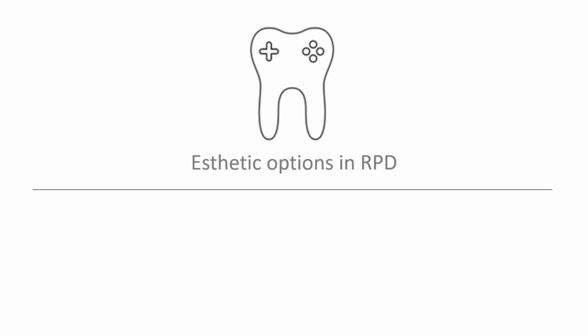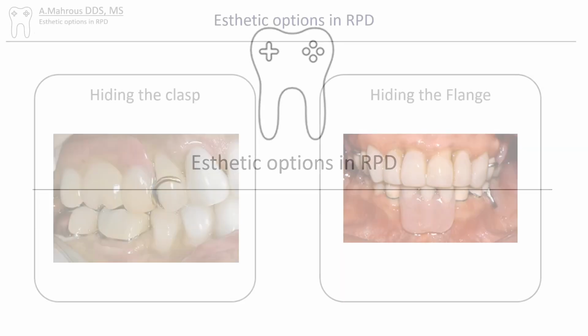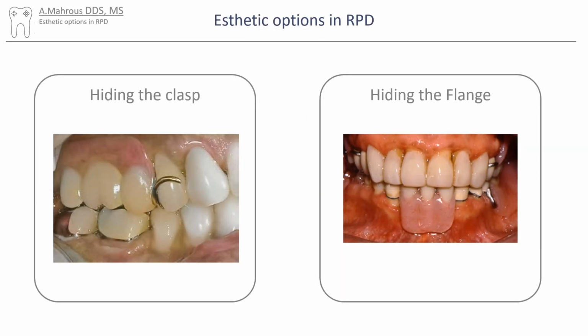In this video, we'll go over aesthetic options for RPD. There are two main goals in making an RPD aesthetic: hiding the clasp and hiding the flange. We'll go over the various techniques that we can use to achieve those two goals. Let's start with the twin flex clasp.